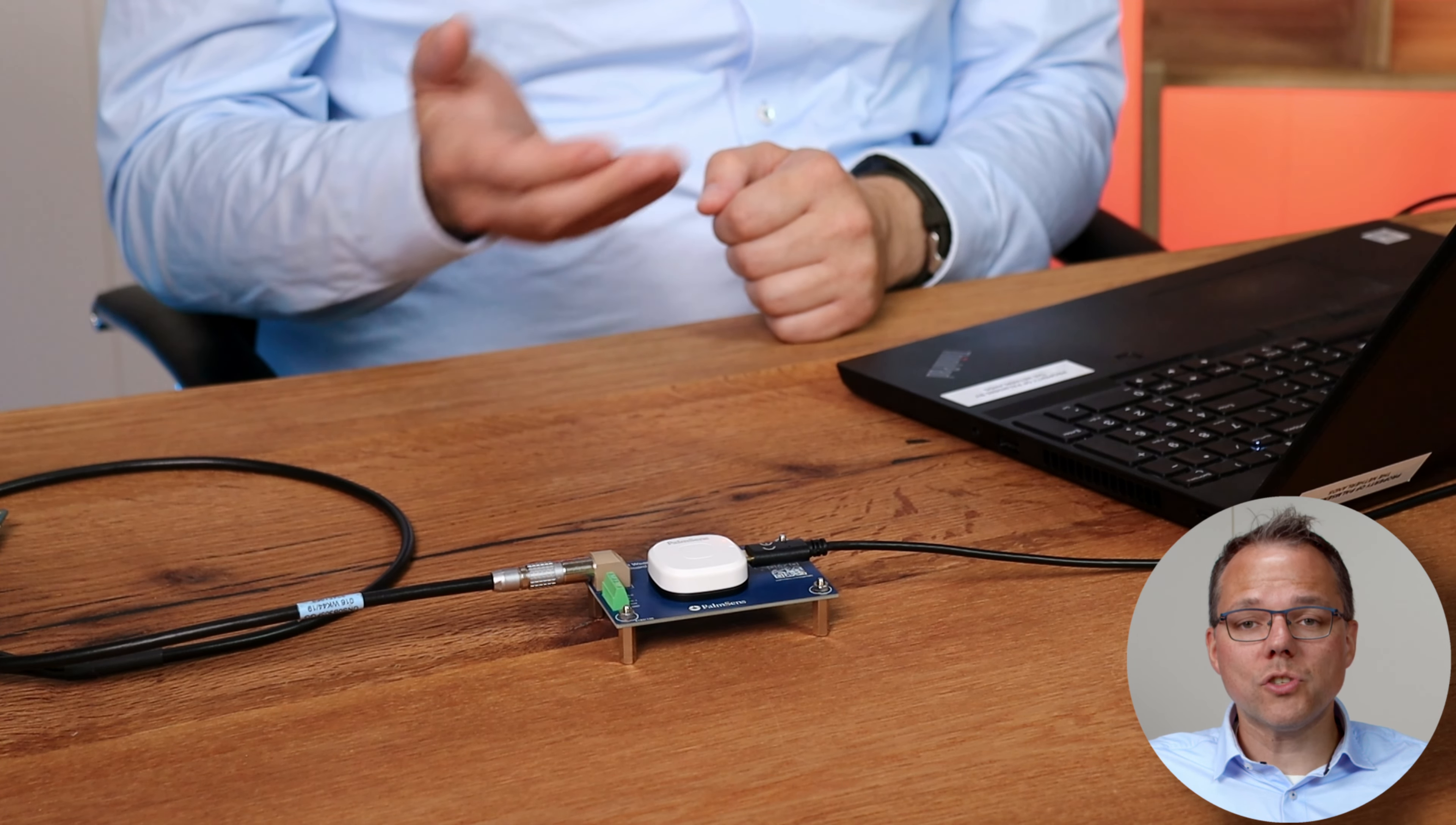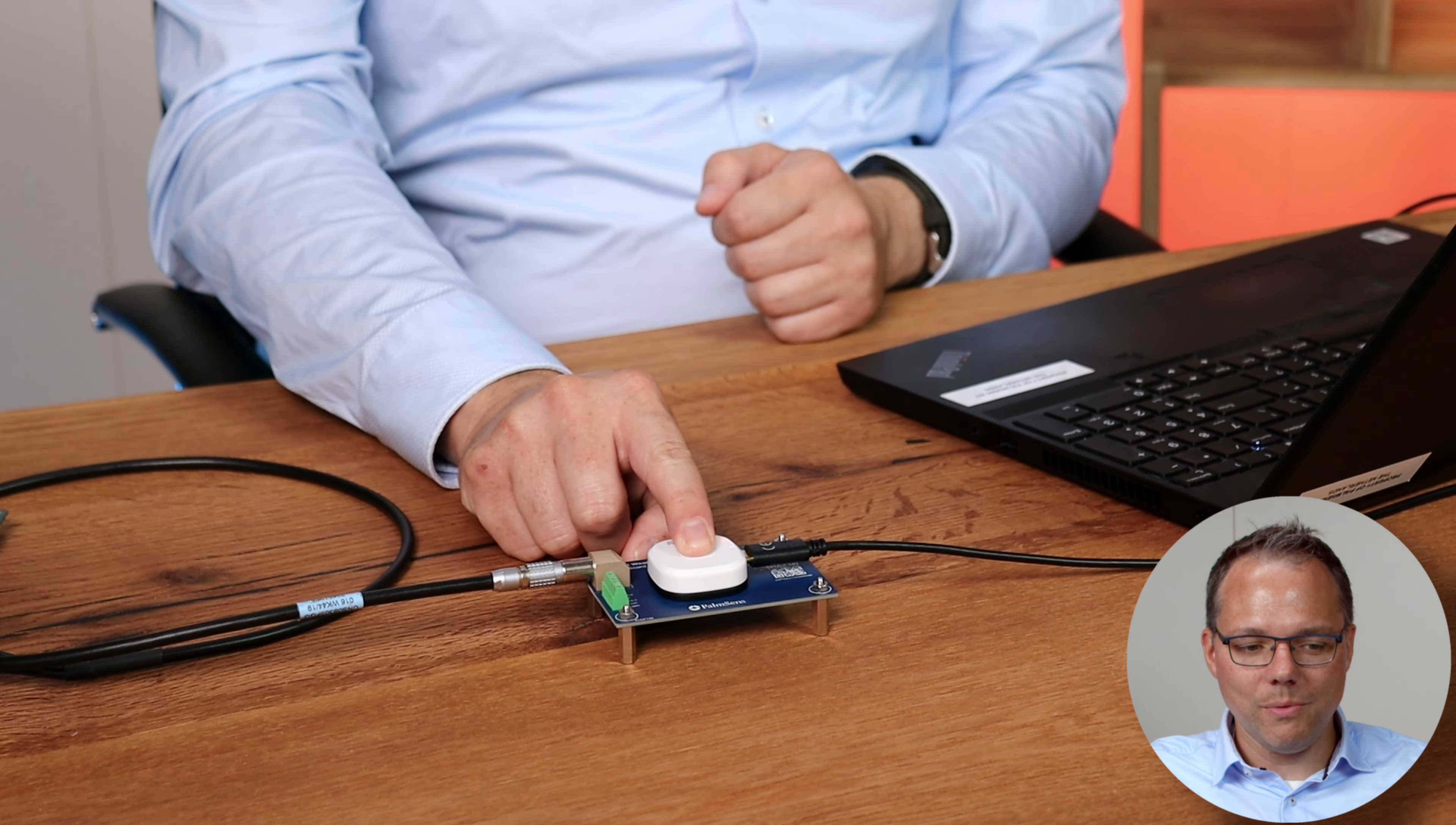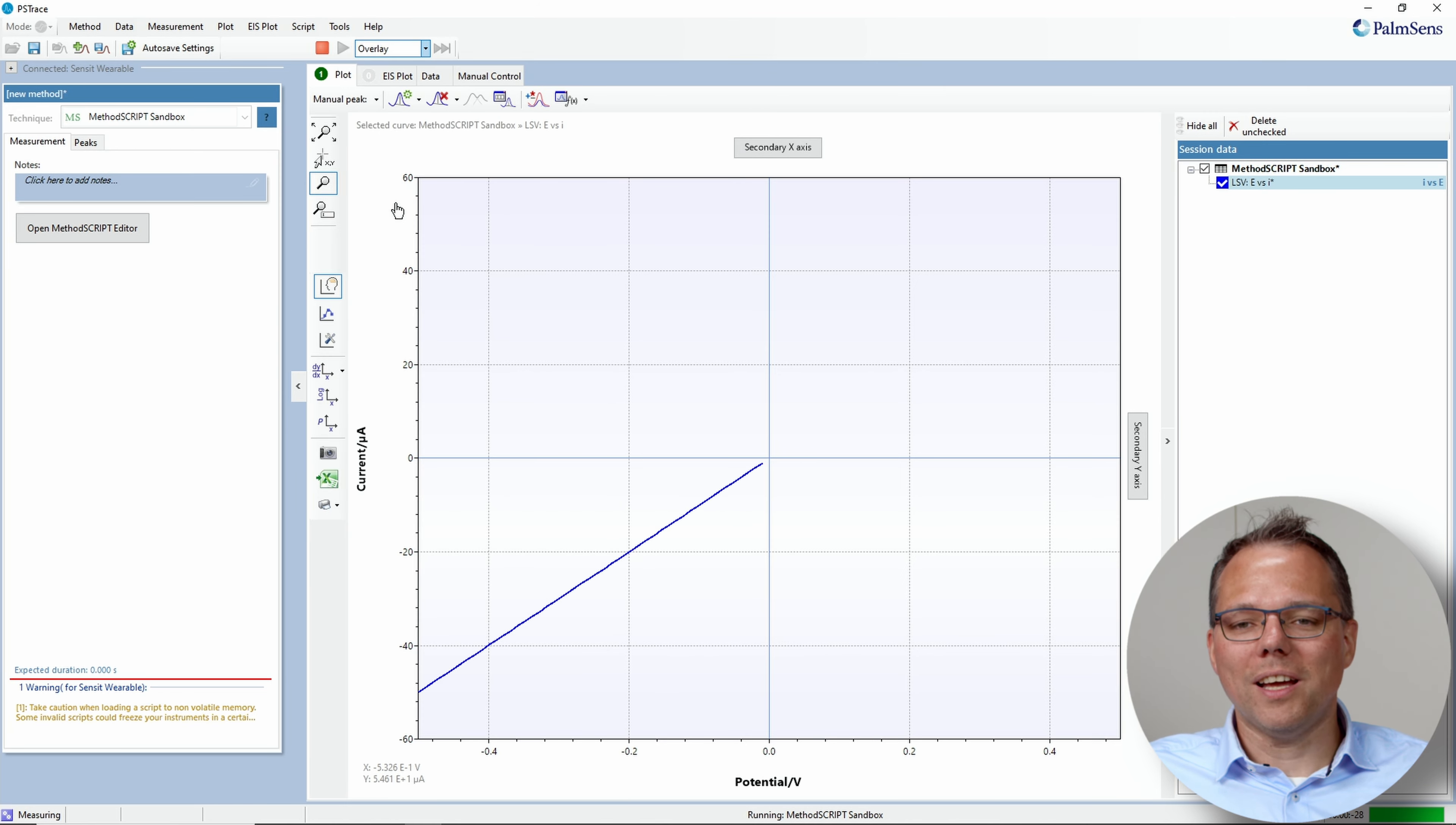Now we just need to wake it up to make a measurement. And we have chosen the option to wake it up when we push the button. So when I push the button, immediately we get again our linear sweep voltammetry.